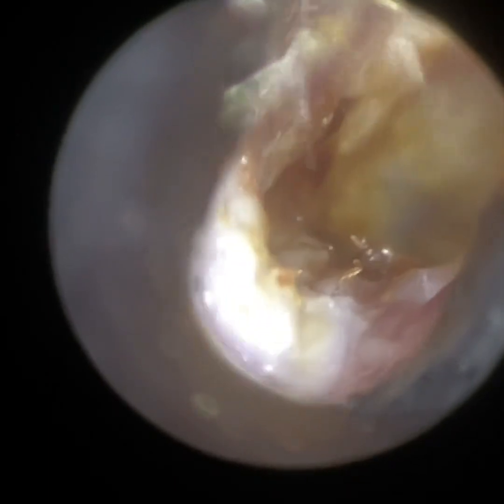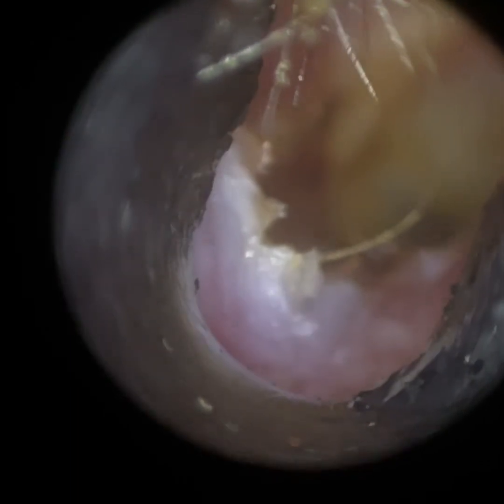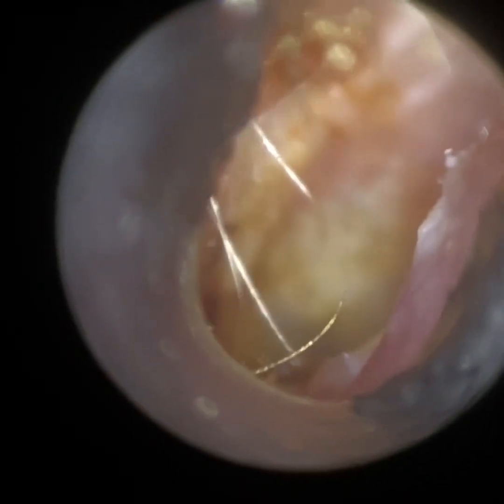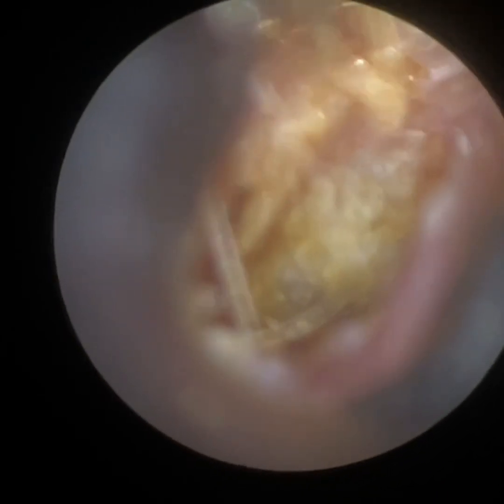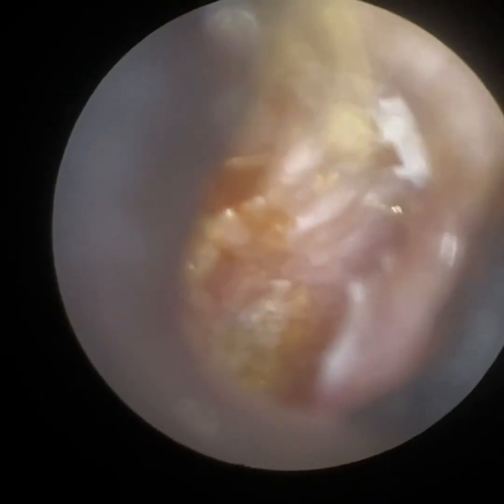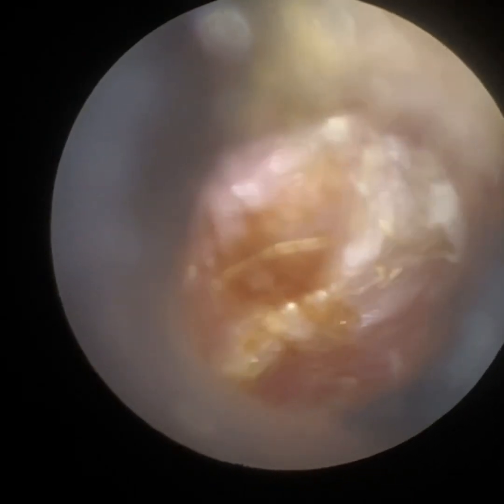So the endoscope is going to enter the ear — that's actually the patient's eardrum. There's just a bit of keratin here; I'm going to see if this peels away. As I said, the patient is suffering from otitis externa with a bit of tenderness here. I've just reduced the brightness — you can see there's a lot of reflection with anything light-coloured. So I'm just peeling this away; I want to make sure there's nothing untoward underneath. Back at the eardrum now — the anterior portion you're struggling to see fully because the canal walls are in the way. Because the eardrum has a very wrinkly appearance, and that's because the patient has been getting a lot of water trying to flush the wax out themselves.